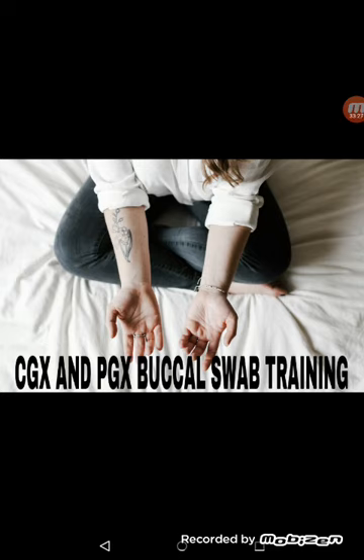PGX testing is exactly the same. You're going to swab. And again, they must have 4 or more medications or 1 pain or anti-anxiety medication. If you are doing a CGX and a PGX testing on one patient, you must do 2 separate swabs.